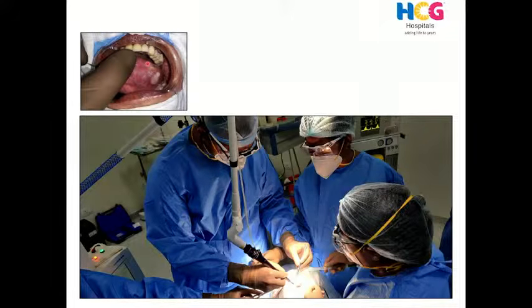So you see this is the hand applicator, and you can see a knob here. So by pulling the knob, you can use it as a focused or a defocused beam. So obviously when you have a focused beam, it cuts very precisely. And as I mentioned, the application of it is only in precancerous lesion. Very superficial lesion, because you go a layer deep, you have small millimeter blood vessel, you have to end up using a cautery. Most of the time, even when you're using a lesion like this, we have to have a bipolar handy to maintain hemostasis.